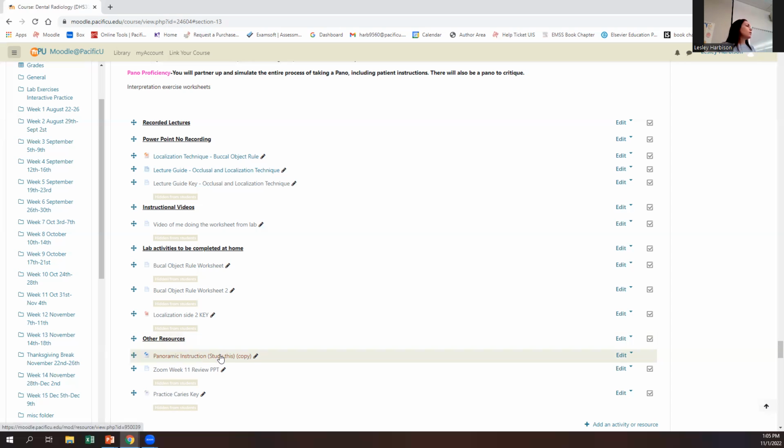And on Monday, we gave everyone the opportunity to go in and practice on each other. We'll do that for the Wednesday group as well. The pano room will be open and you can just go in there after, because everyone's doing great. Not to make the Wednesday group nervous, but everyone on Monday did great with the time. So you should feel confident going in. You guys are doing an excellent job taking x-rays, excellent job critiquing. I'm really excited about how well you all are coming along.